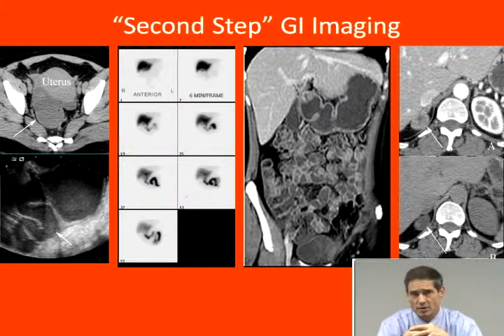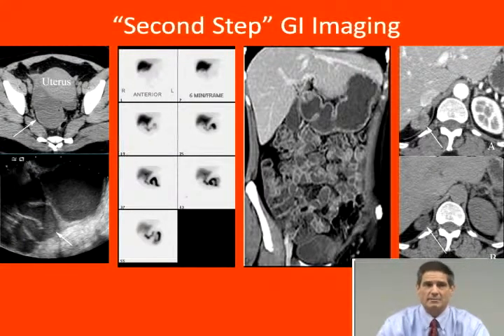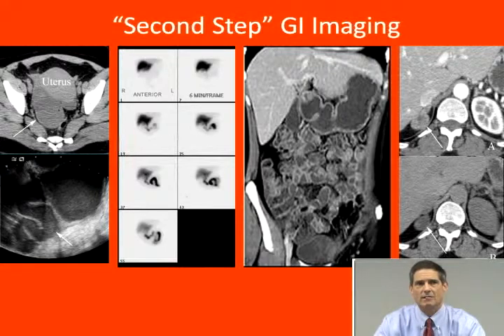The first of which is that women with low abdomen and pelvic pain may need both CT and ultrasound for evaluation. You may need more than ultrasound for the evaluation of right upper quadrant pain and suspected biliary disease, especially if there are abnormal enzyme studies. You may need small bowel imaging with additional evaluation after a standard CT study. And finally, CT can discover incidental lesions, or sometimes it's performed in asymptomatic patients. And I'll cover these topics today.